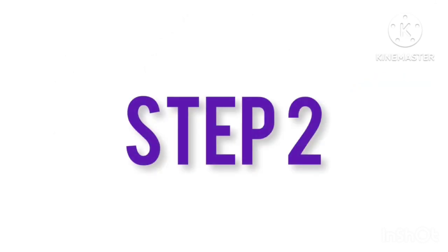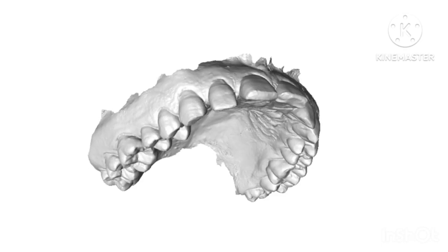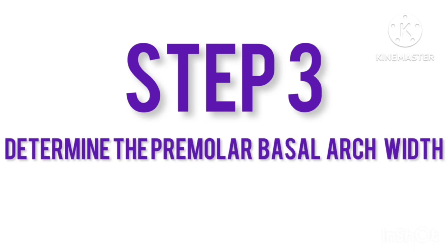summed up. The second step is to determine the premolar diameter, for which the arch width is measured from the tip of the buccal cusp of one first premolar to the opposite first premolar. The third step is to determine the premolar basal arch width. The canine fossa, which is found distal to the canine eminence, is measured from one side to the next side.